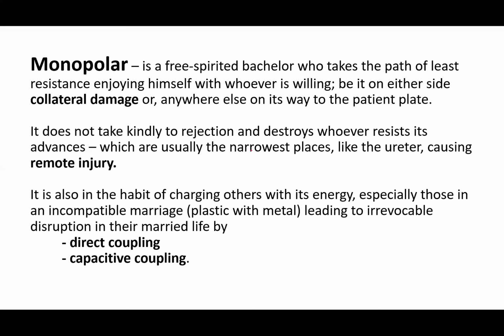Anything along its way, it can destroy. You can see monopolar is relatively more dangerous than bipolar, okay? Because the distance it is crossing can cause serious damage, especially along the path of least resistance.